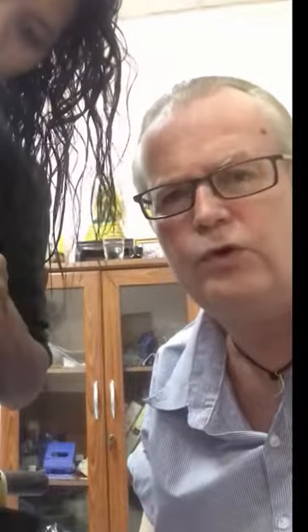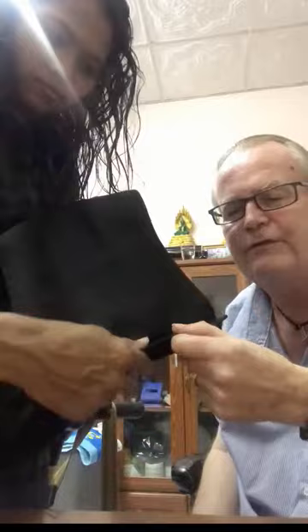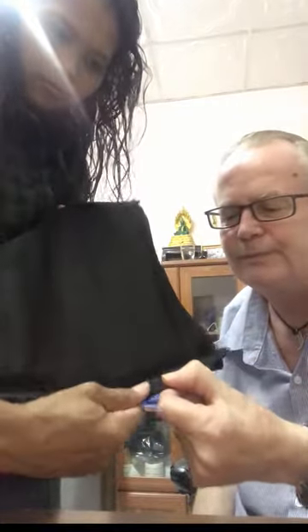So I designed this bag so that everything would be on the hook and loop system, because even though I've got no use of one of my arms, I can still lean against it and actually undo the catheter bag cover to empty the fluid. So at the bottom, May has now put the catheter bag pipe around like so, and when you want to empty your catheter bag, simply at the bottom here you can see there's enough material to grab hold of and you open it up and just take out the outlet pipe.